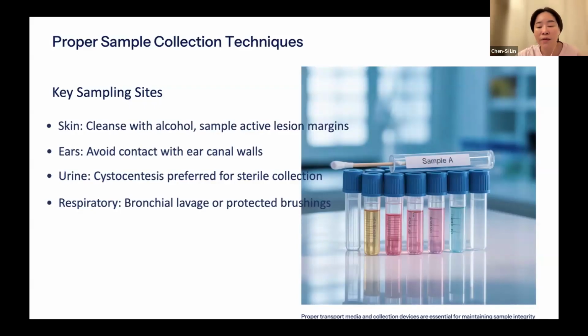So with free catch samples, we may get a lot of bacterial results. However, these bacteria may not be the main pathogens resulting in the bladder infection. So yes, this is the thing we need to pay attention to.